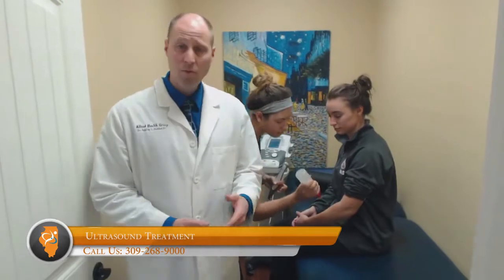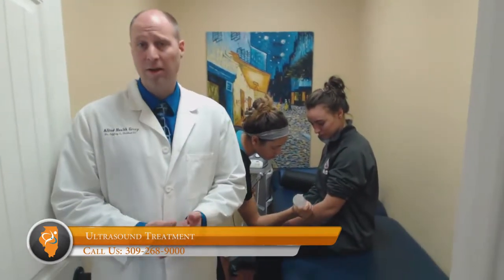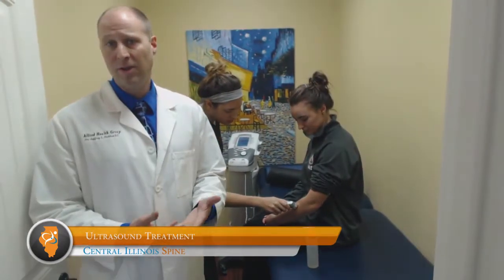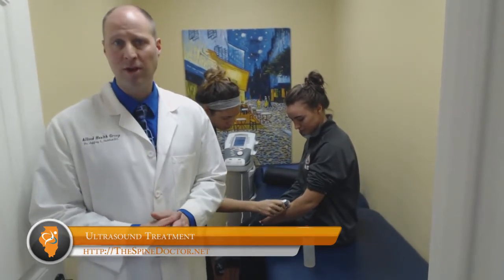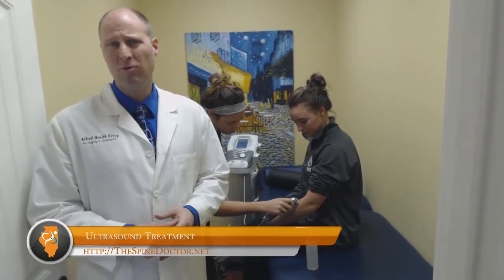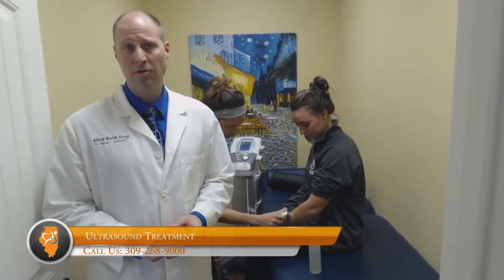When we do this treatment, we put down a gel that conducts the sound waves from the head of the unit into the tissue. It's not a painful process — you usually notice a warm type sensation, and a lot of times patients will say that they can feel the muscles relax or feel a loosening in that region when it's being done.